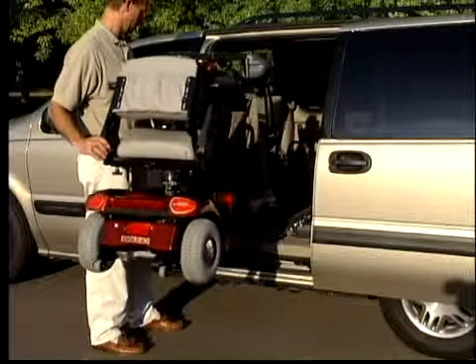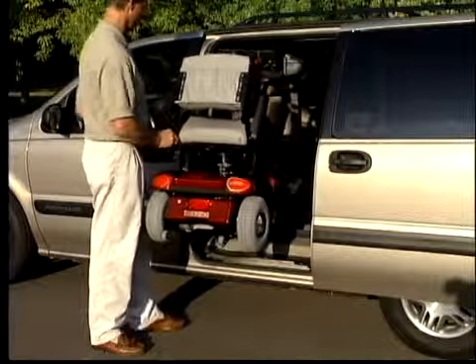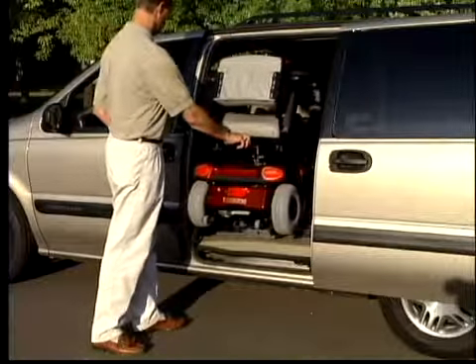Once the scooter is at the proper height, push the in button. When the scooter is inside the vehicle, press the down button to set it on the floor of the vehicle.